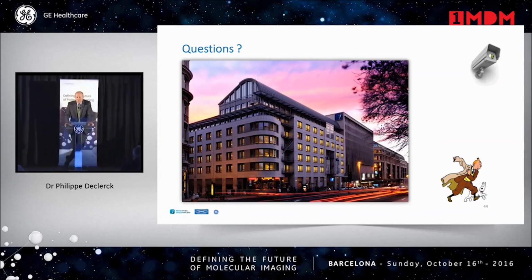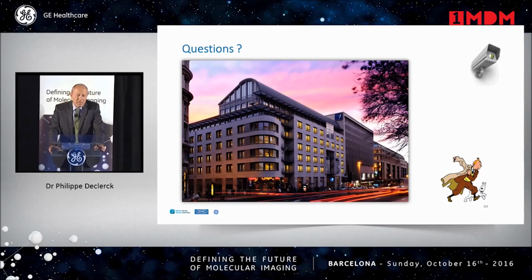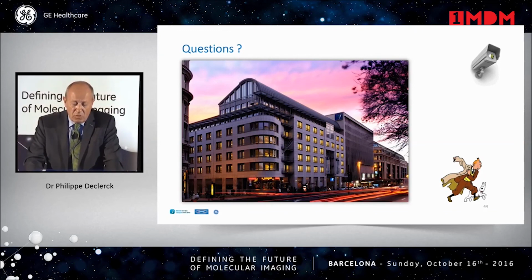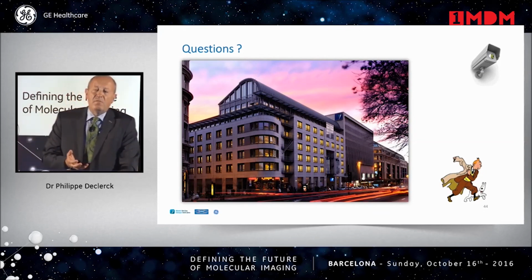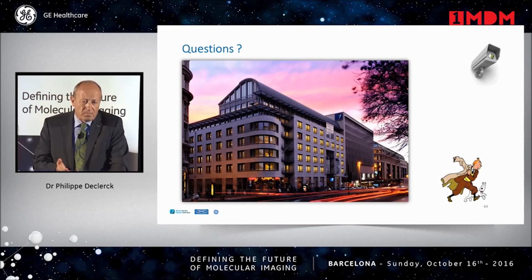I think we will have to choose according to our patients. For elderly patients and cancer patients or ill patients, we can go for time reduction because they have to work fast. And irradiation of old patients and cancer patients is not an issue. But for young patients, young women and children, there I think we should go for dose reduction. Okay, very clear. Thank you.